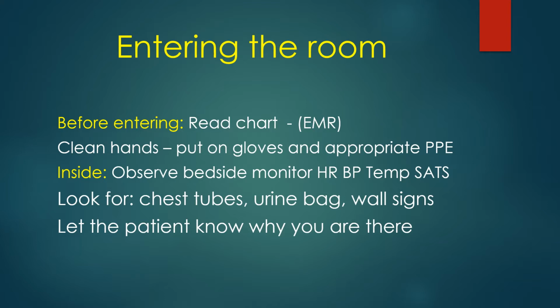Maybe the patient has had an x-ray since the last time you looked at his chart, and so you would want to look at his x-ray and see if there's any changes in that. Of course, you want to clean your hands and put on gloves, and if the patient's in any kind of isolation, you want to put on the appropriate PPE.